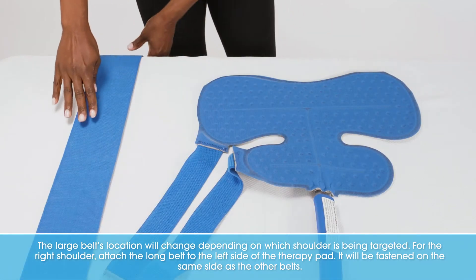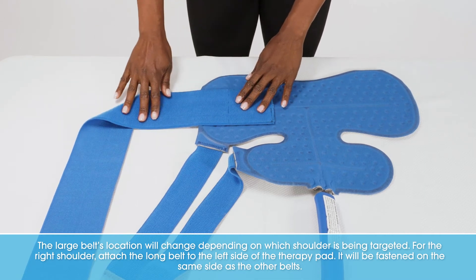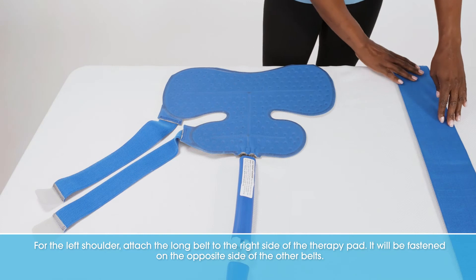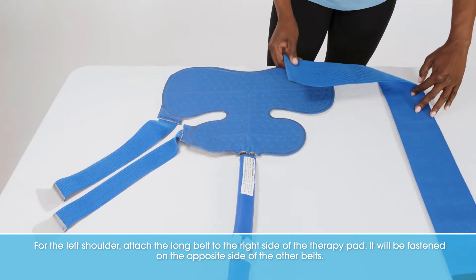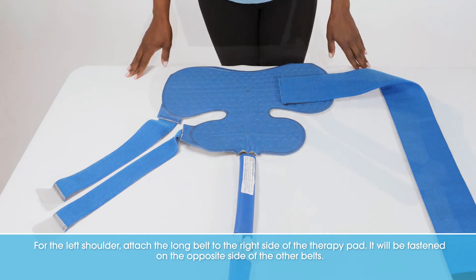For the right shoulder, attach the long belt to the left side of the therapy pad — it will be fastened on the same side as the other belts. For the left shoulder, attach the long belt to the right side of the therapy pad — it will be fastened on the opposite side of the other belts.